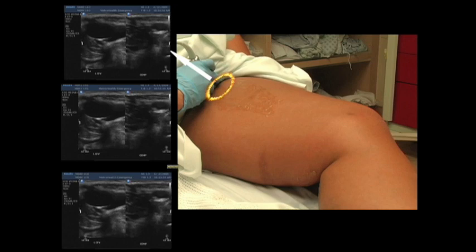A similar composite image of the bifurcated femoral veins and the popliteal vein showing both its native and compressed state is mandatory. The end result in a negative study yields 3 side-by-side images, each appropriately labeled.